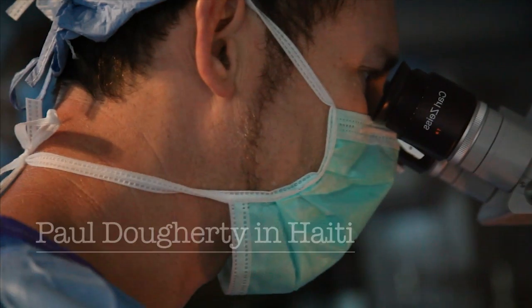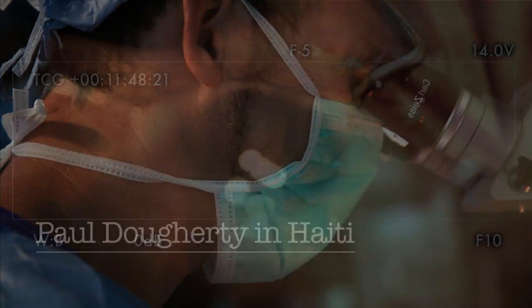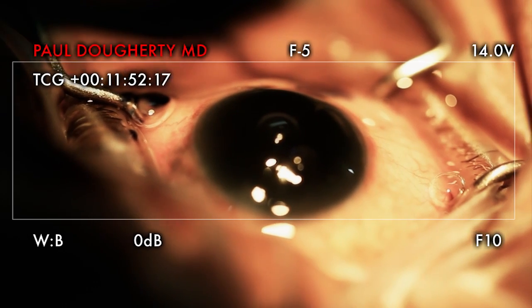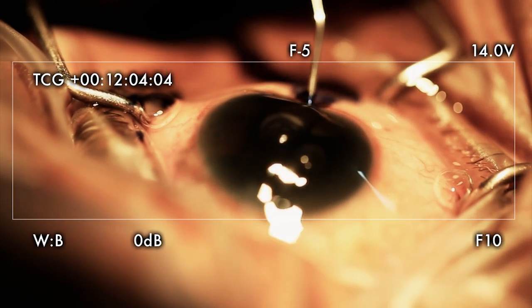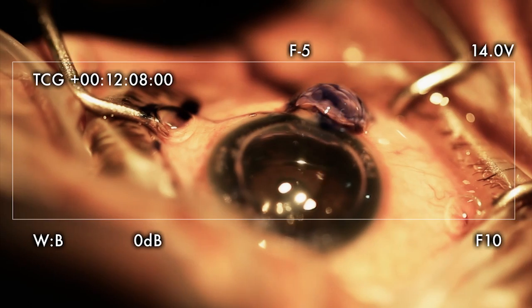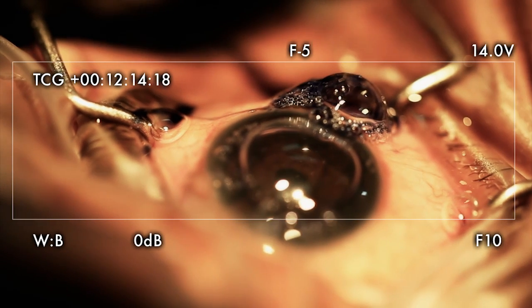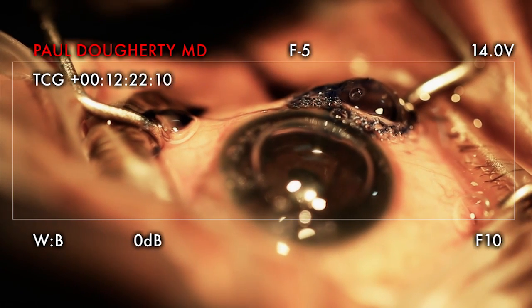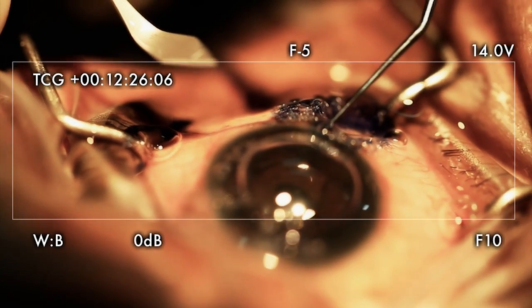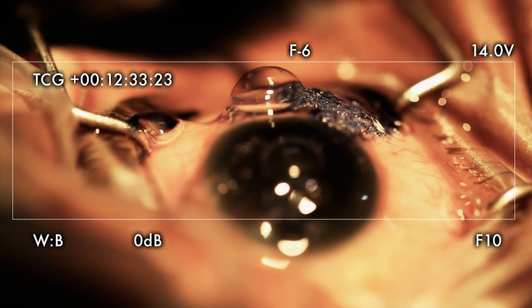Is she okay? I want a viscoelastic. Let's get comfortable with my body here. I need to go in the eye. Thank you very much. We have a little BSS for us to get that viscoelastic.